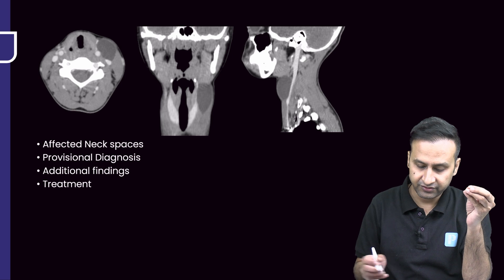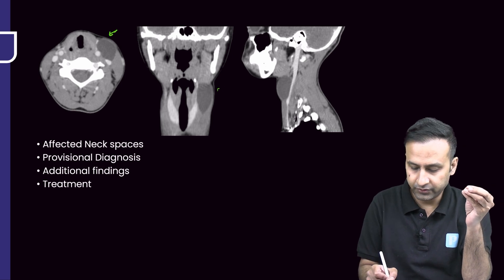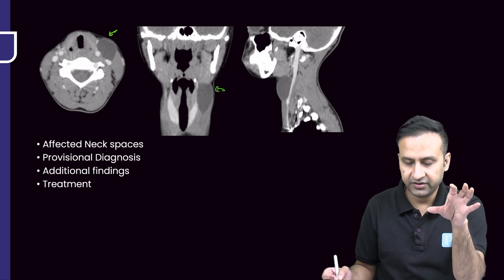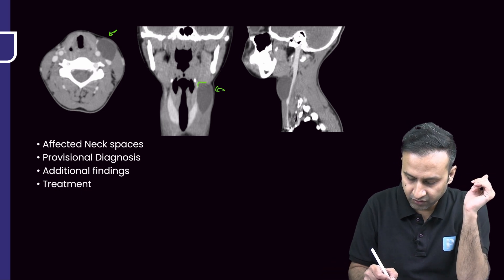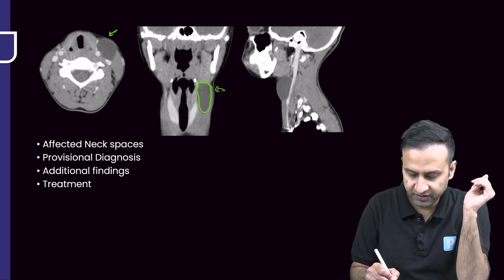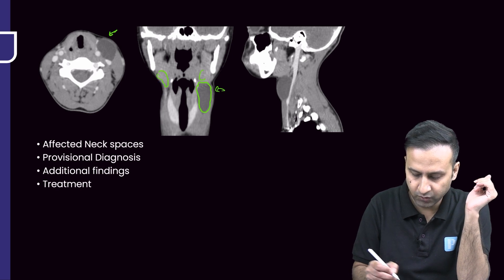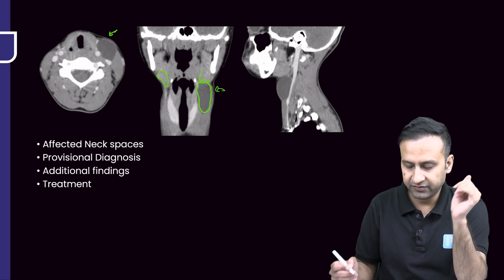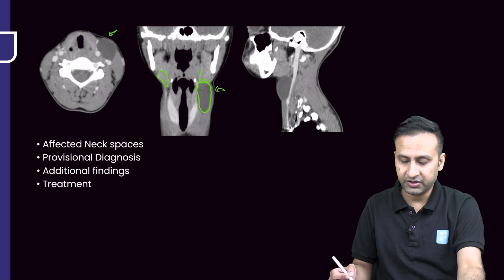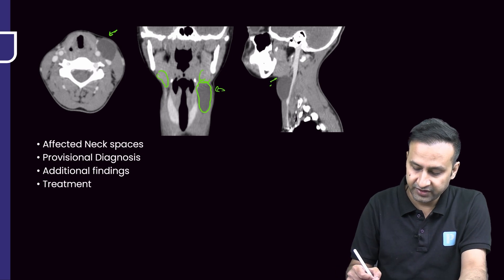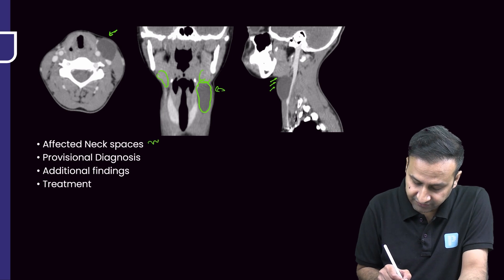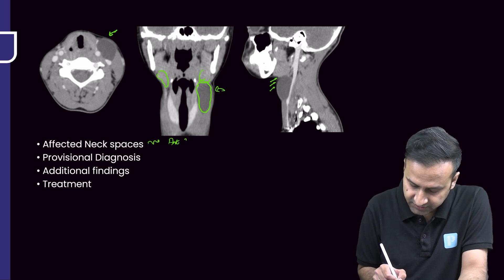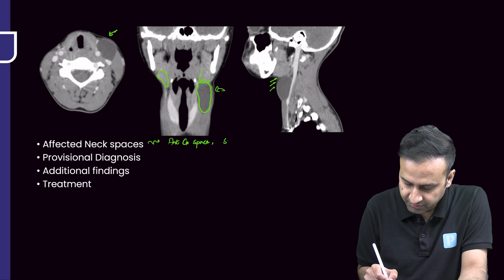Looking at this particular image — the lesion is present on the left side of the neck, very clear. You can also see that it is extending up to the submandibular space. This is the submandibular gland on this side; you can see the submandibular gland quite well here. The inferior part of the submandibular gland appears to have been pushed by this lesion, which is very well seen even on this sagittal reformatted image. So the neck spaces affected are the anterior cervical space along with extension into the submandibular space.